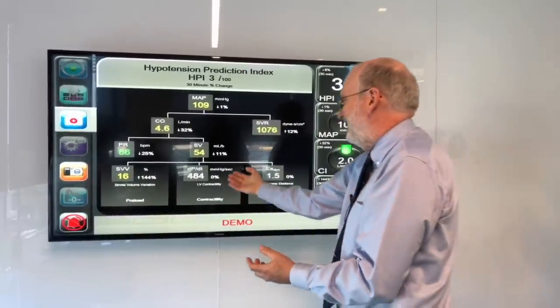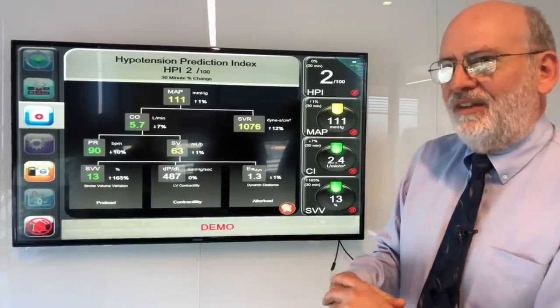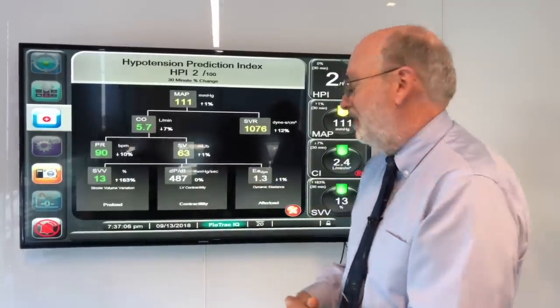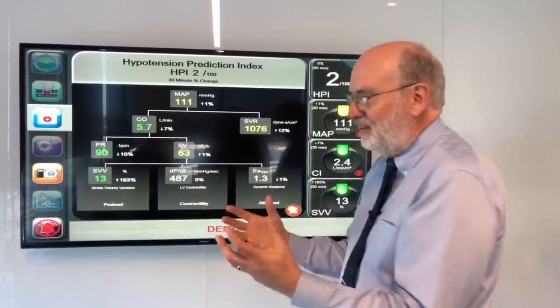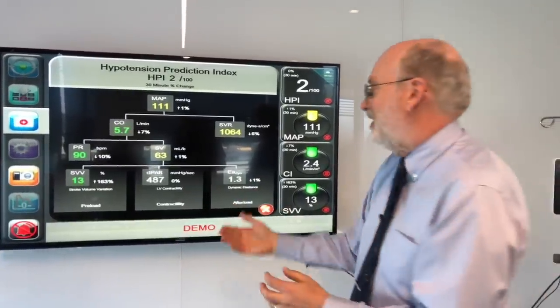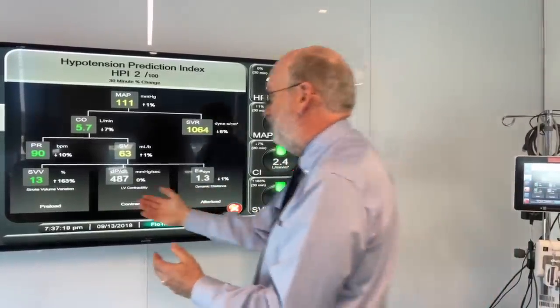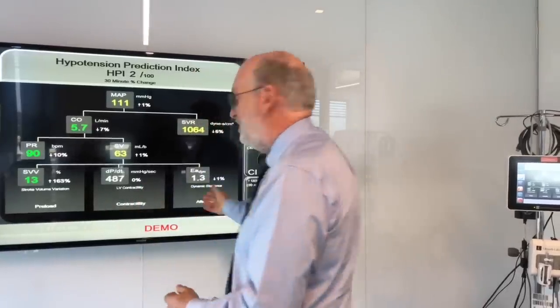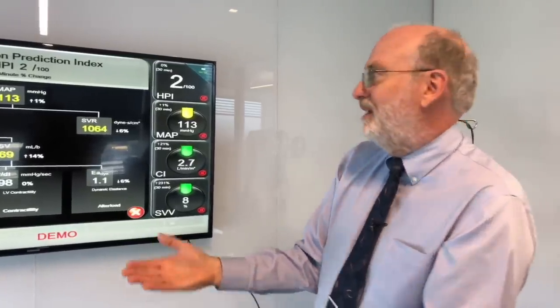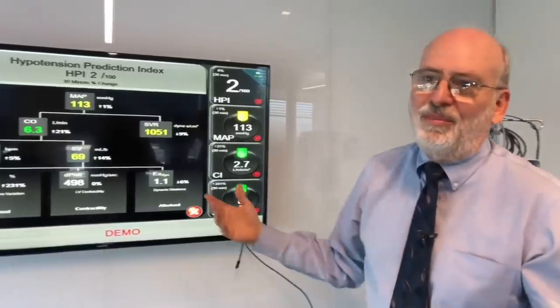And then it has this other measurement that, maybe it tells you how well the heart's doing. So that would tell you if you needed to give an inotrope. And another measure here that supposedly tells you how compliant the vascular system is. This would tell you if you have to give a vasoconstrictor or not. And by looking at how these numbers change, it tells you if you should give more volume, more inotropes, or some afterload increase. So supposedly it puts you in the right category for treatment so that you fix the pressure but don't hurt the output. That's what this is supposed to do.